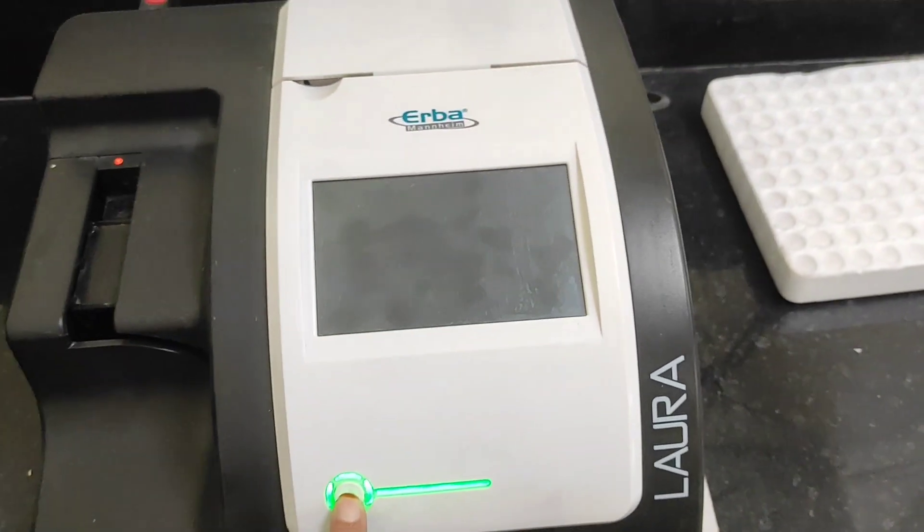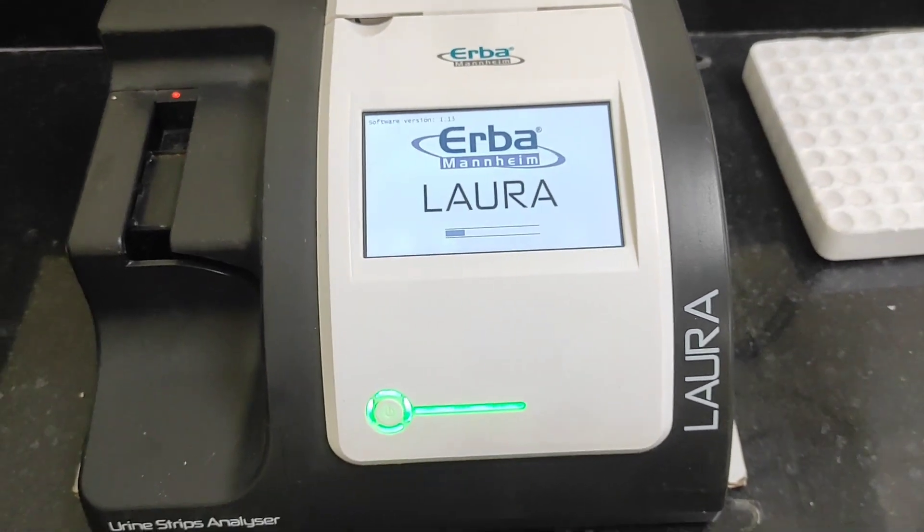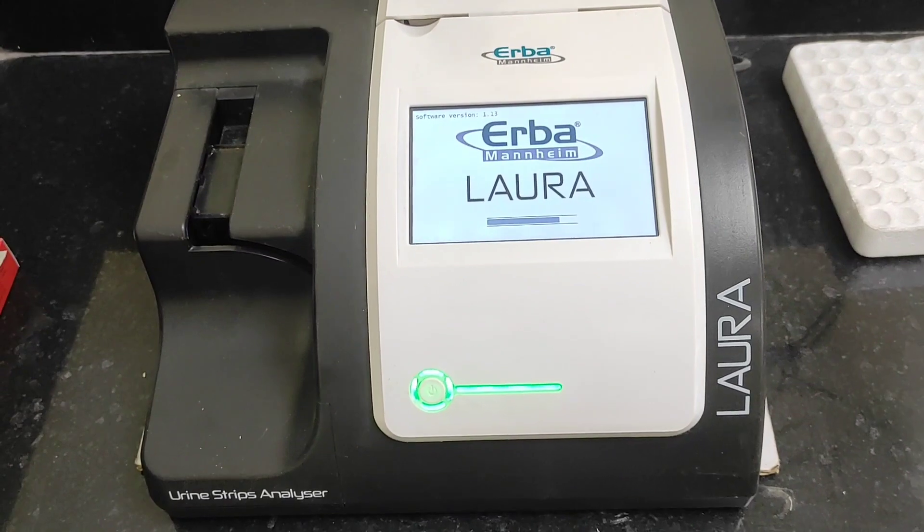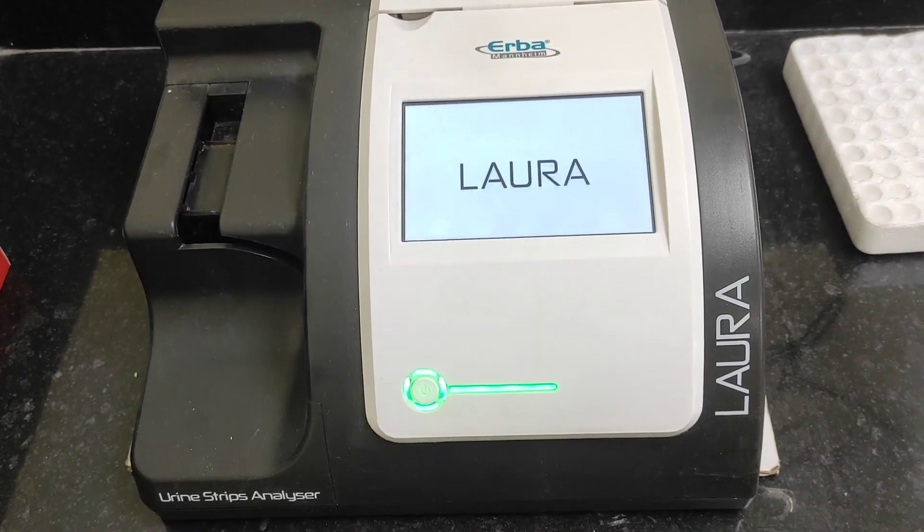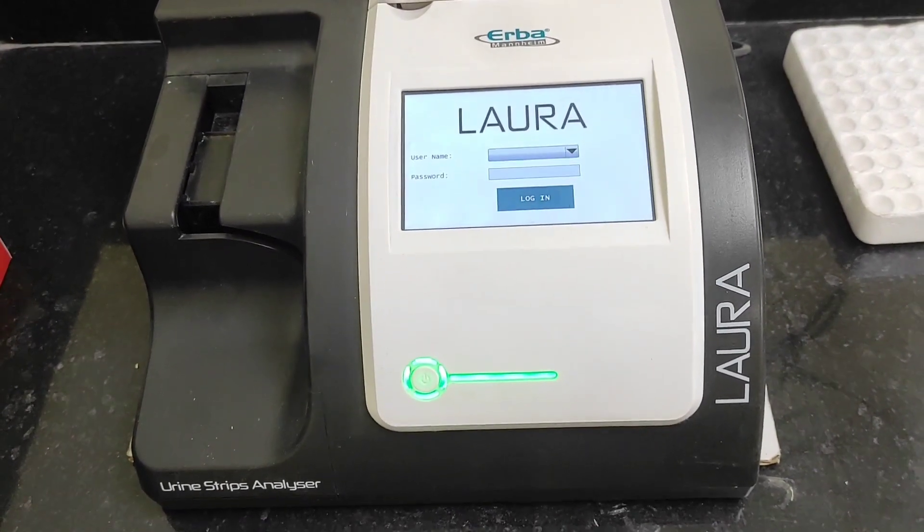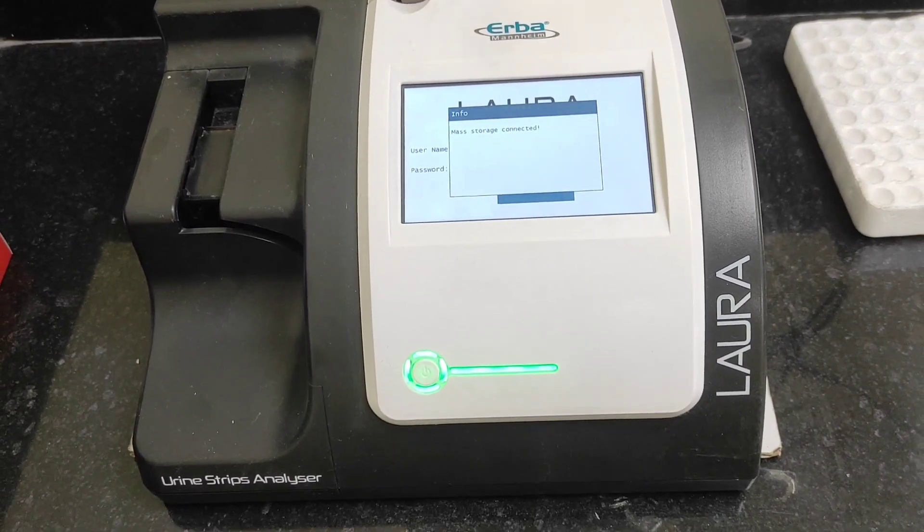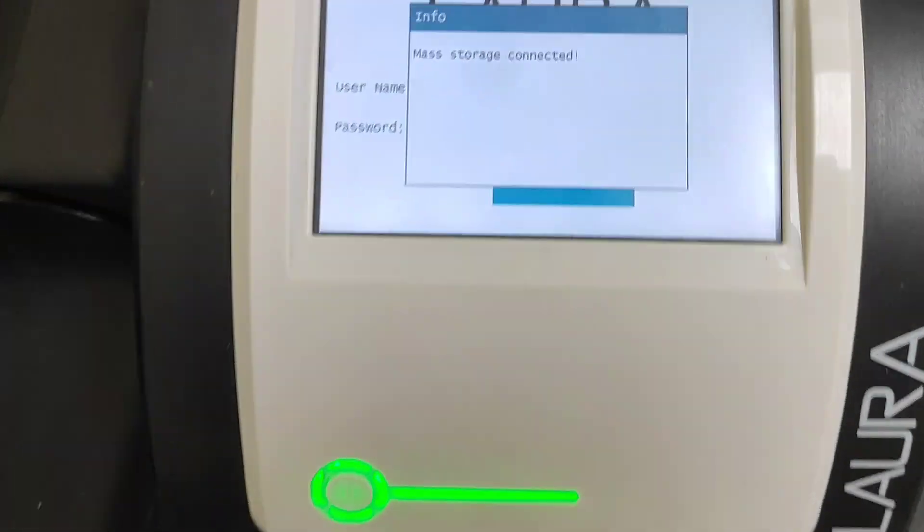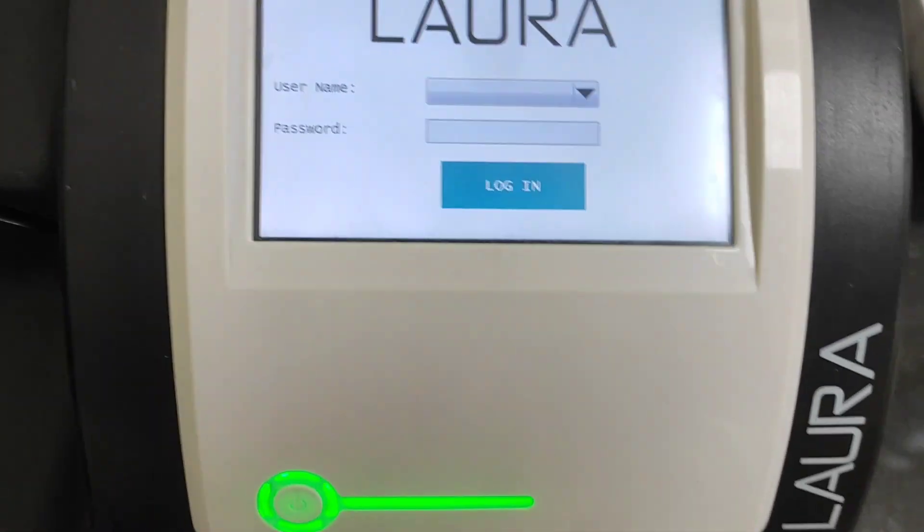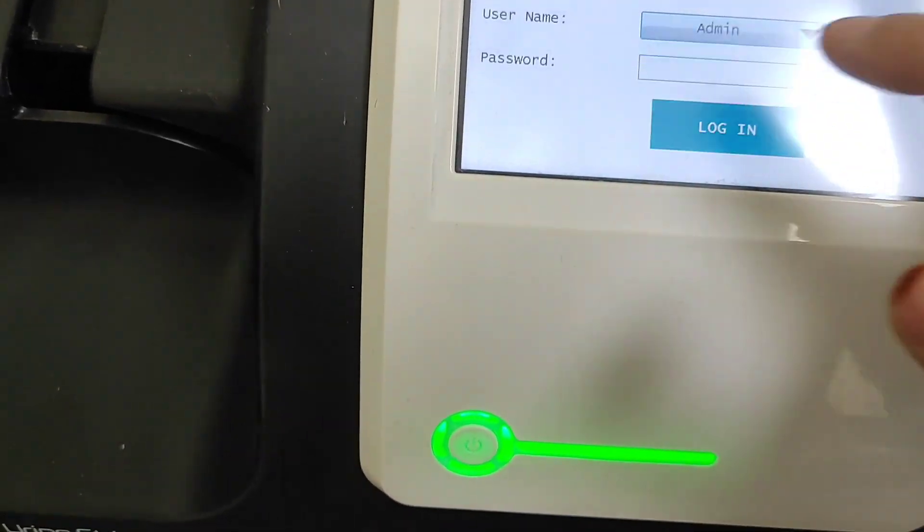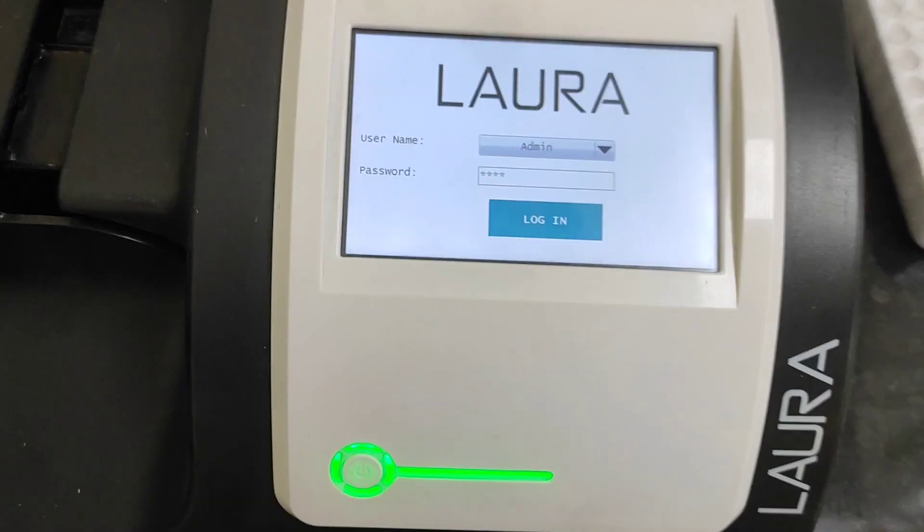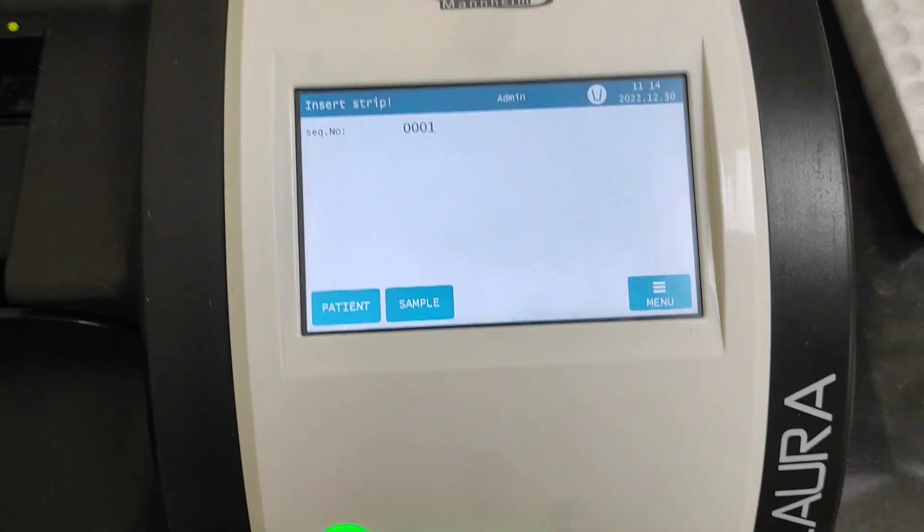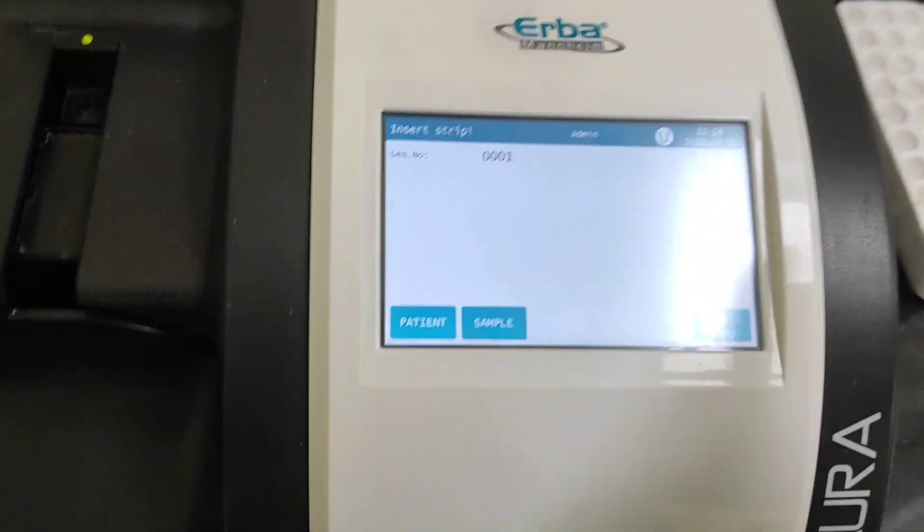As you can see, mass storage connected. So now we'll give the password. Okay, password is entered. So this here is the main menu of the analyzer.